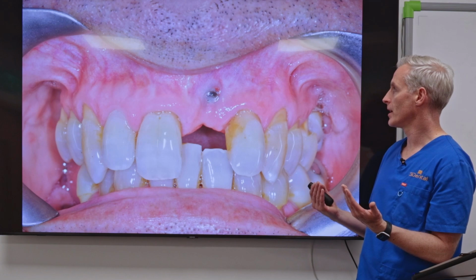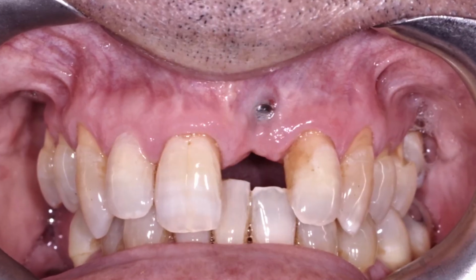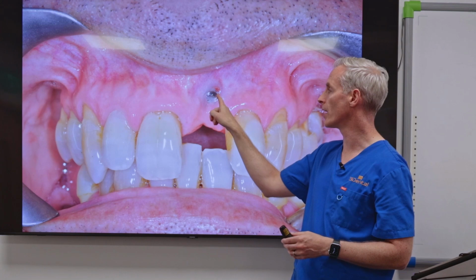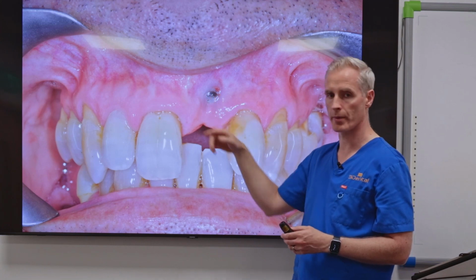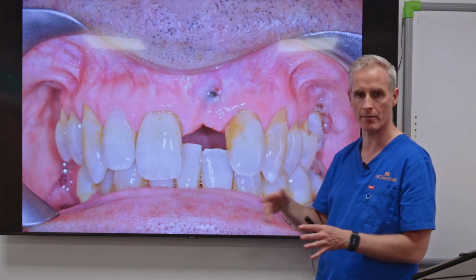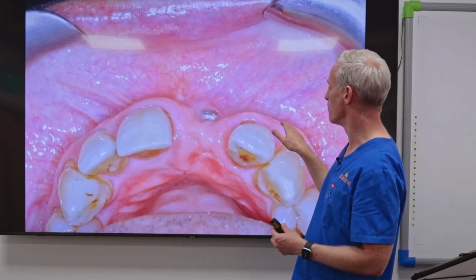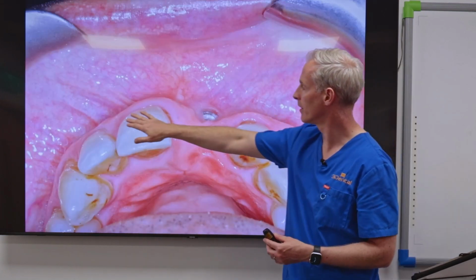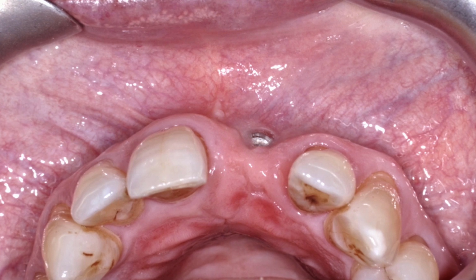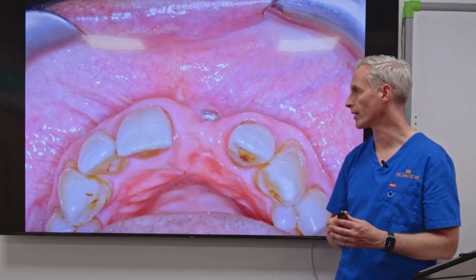This is how my patient came to me. His lips are retracted, they're lifted back so you can see exactly where his implant is. He's missing this tooth here, right at the very front of his mouth, and our implant is quite high up here. I think you can already determine that it's probably not in a very good place to be able to put a tooth on. And when we look at it from underneath, the gum and the bone are out here along the teeth, but when we get to the implant it really dips in. So we've certainly lost some tissue, whether it's hard tissue, bone, or whether it's soft tissue, gum, and we'll determine that in a little bit.